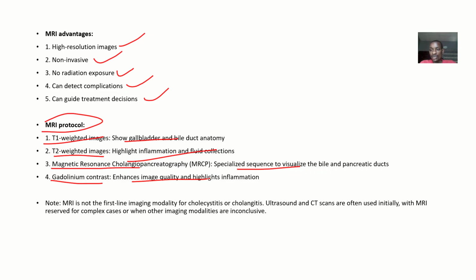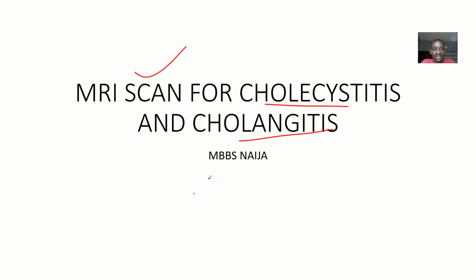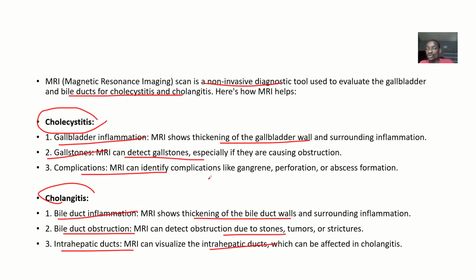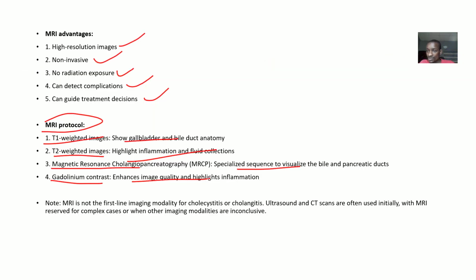So that's it about this MRI scan for cholecystitis. Basically, the characteristics of the MRIs to see if these conditions actually exist, the advantages, and the MRI protocol.